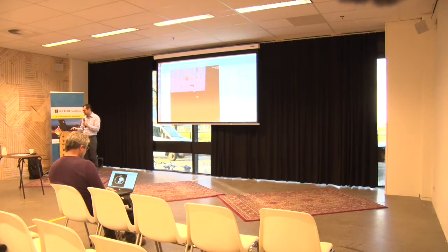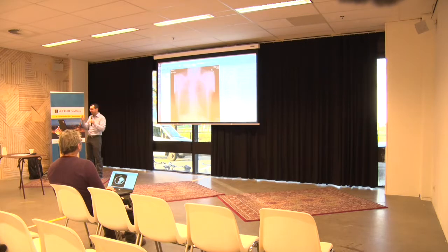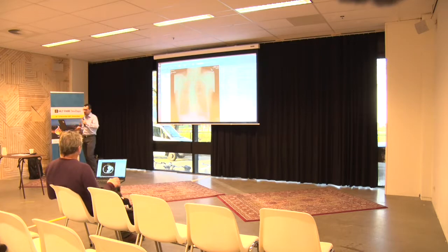Let's open up another one. There's a better one for this sample that will show better. Yeah, here's an X-ray. And let's do some window level on this one. So I press and hold. It's not a great example, but sometimes adjusting the brightness in window level helps you see things better. So for example, if you want to see soft tissue versus, let's say, bones, or the other way around, that's what brightness and contrast is usually used for.